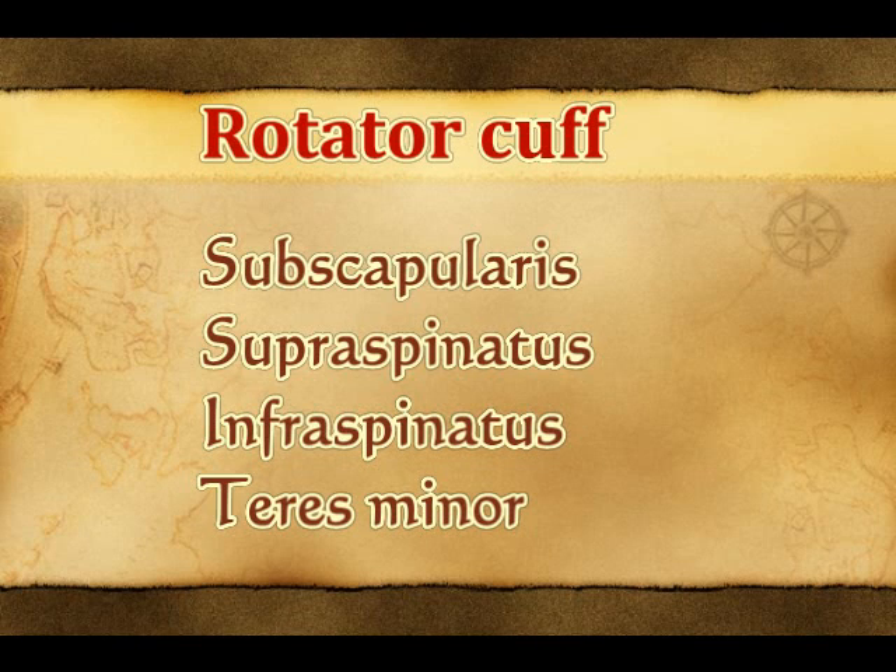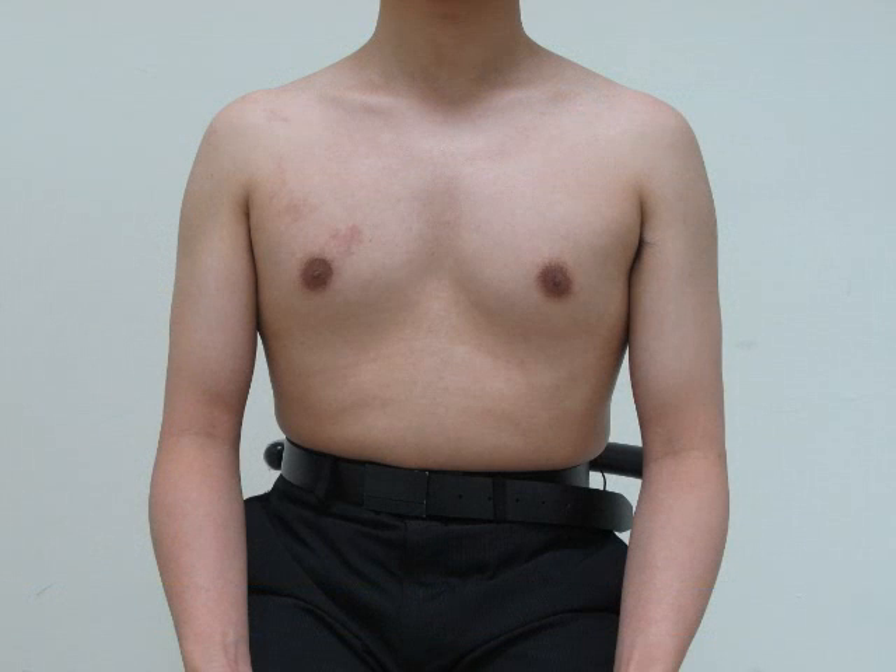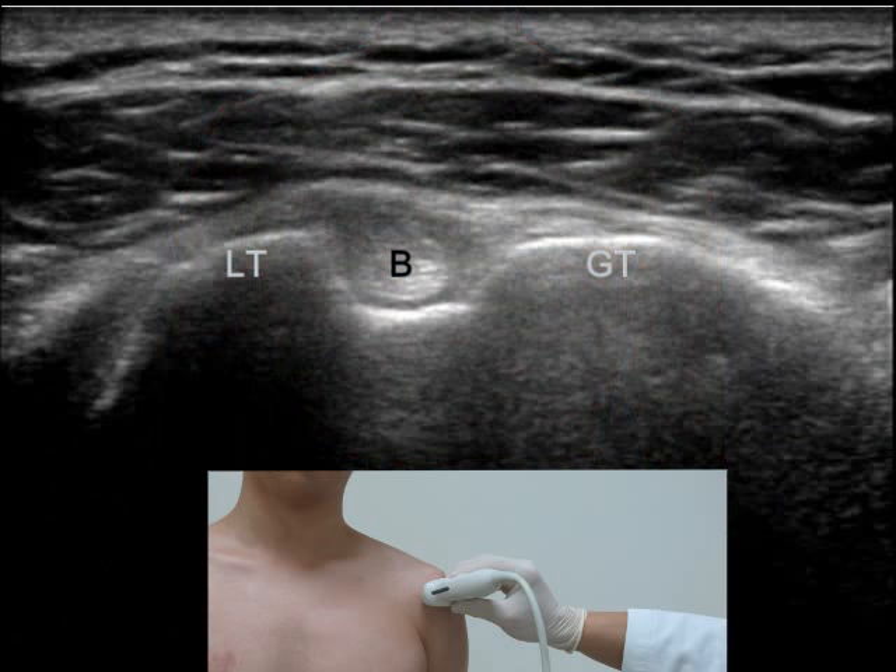The rotator cuff is composed of four tendons. We usually scan the tendon in the order of subscapularis, supraspinatus, infraspinatus, and teres minor tendon. In scanning the shoulder joint, the patient is usually positioned to sit upright on a stool with the forearm on the laps.